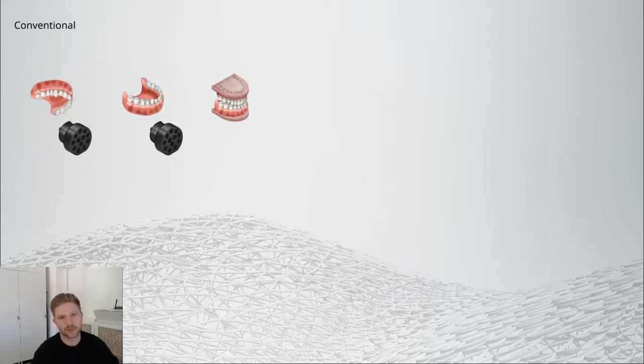So we are starting with the upper jaw, and for the presentation or the segmentation you can use the multi-die adapter, for example, or you can perform a second die scan. You have to do the same for the lower jaw. First you perform a global scan, and afterwards you use the multi-die or the second die presentation. The last scanning step is, of course, the vestibular scan.